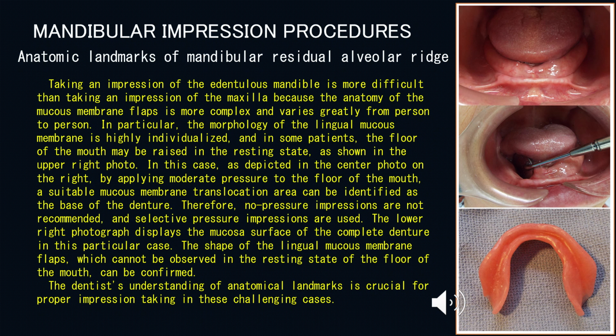Therefore, no pressure impressions are not recommended, and selective pressure impressions are used. The lower right photograph displays the mucosa surface of the complete denture in this particular case.